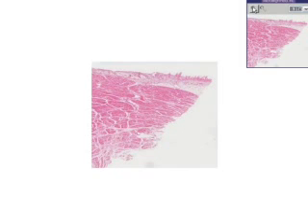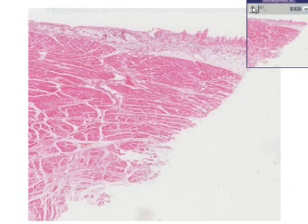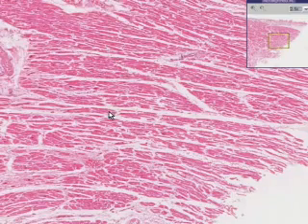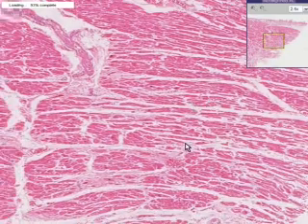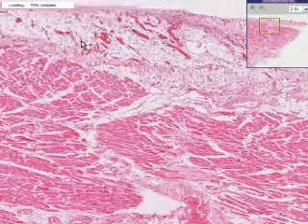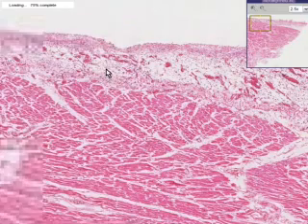Let's start with another logical case. What you can appreciate from the screen is a piece of muscle that's getting bigger and bigger, and pretty soon we'll recognize striations on this muscle. The nuclei are located centrally rather than peripherally, and there are cross-branching fibers — so that makes this myocardium. It's fairly good myocardium.